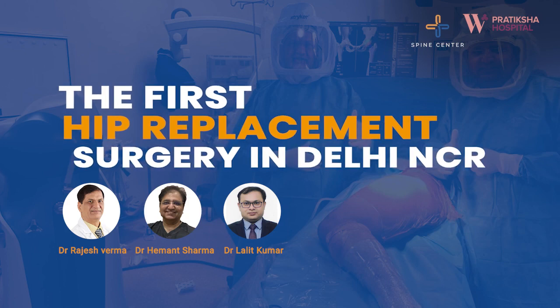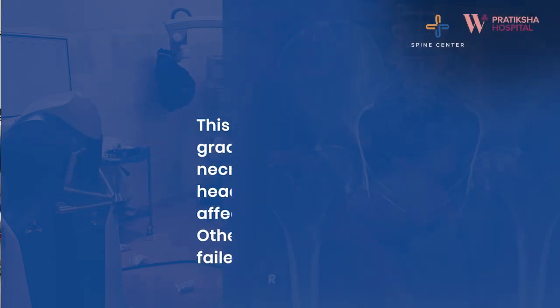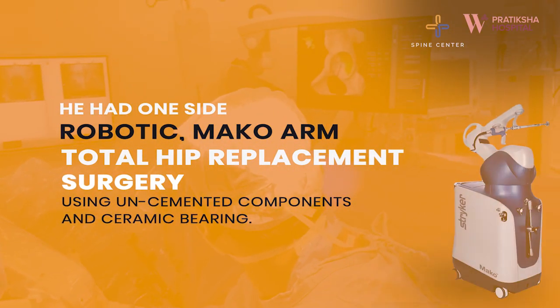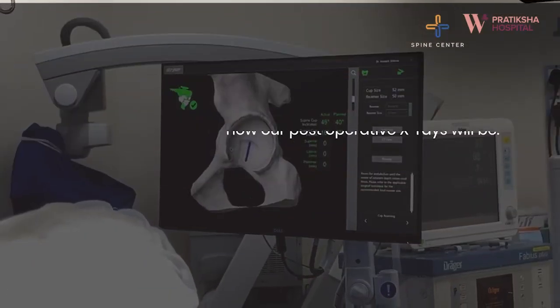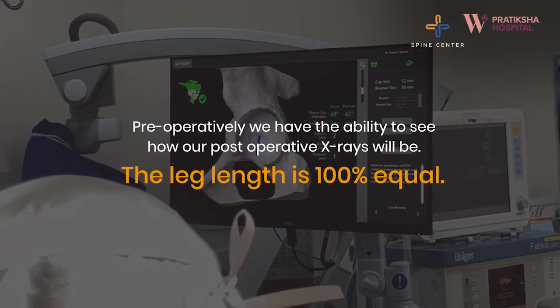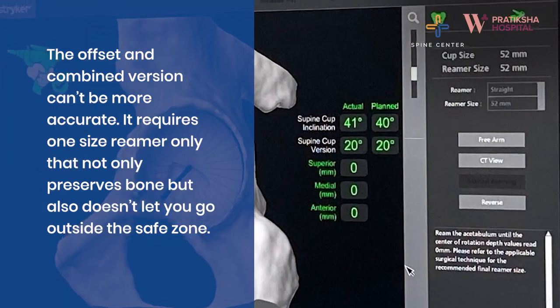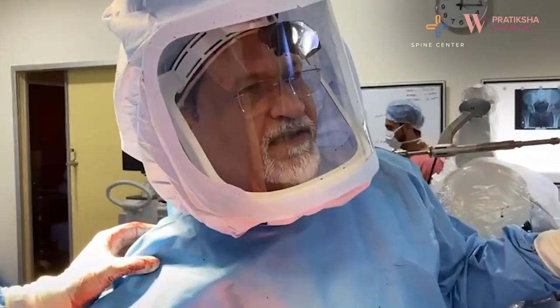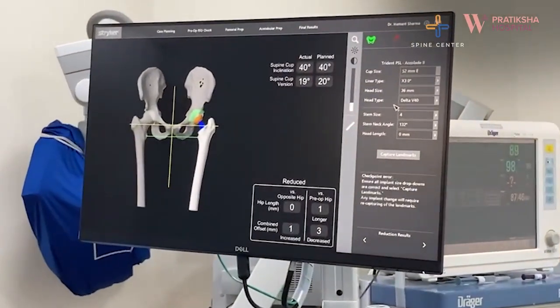I'm going to show you how to do this. Our inclination and anteversion were planned at 40 and 19. They are now in position. We are at 43 degrees at this time.